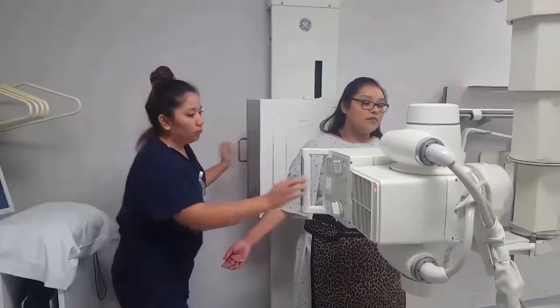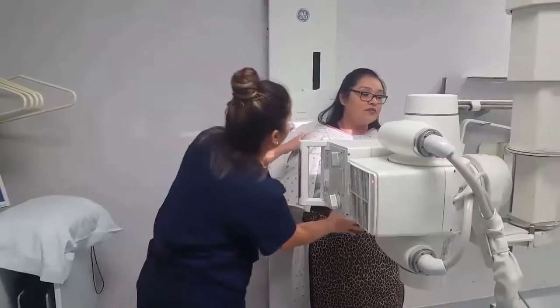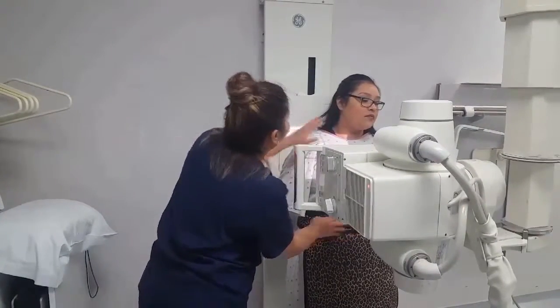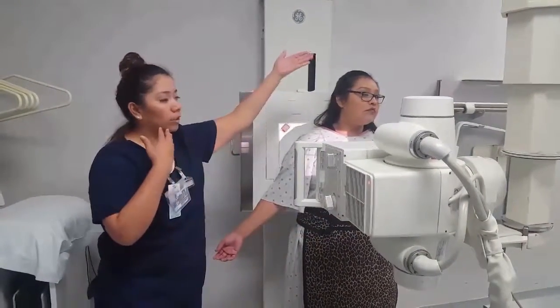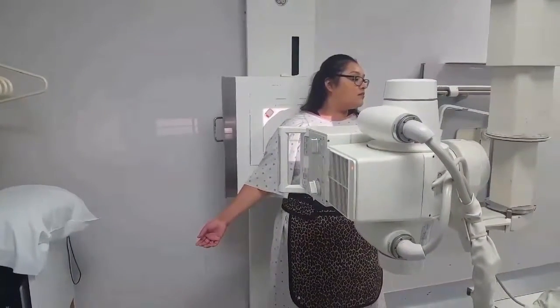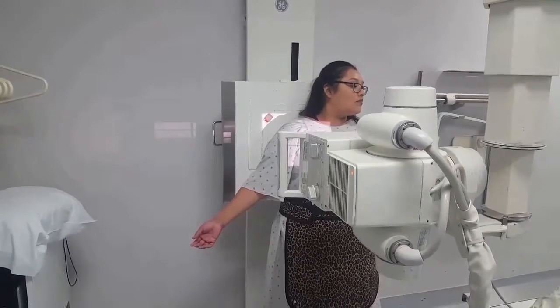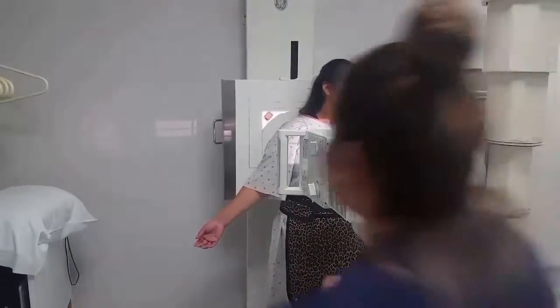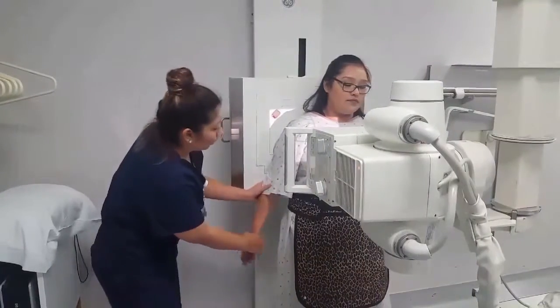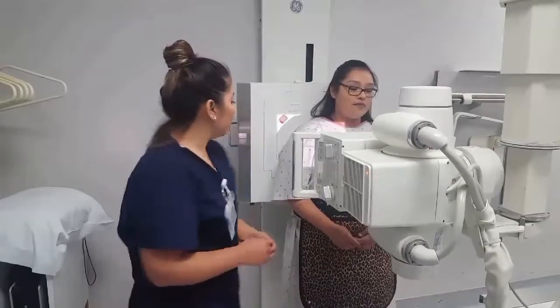Same orientation. So ma'am, if you could stay in that same position you're in, making sure she's there. Her chin is towards the left side. Follow my breathing instructions, please. Take a deep breath in and hold it. Breathe, x-ray. Thank you. You can breathe now. And our technique for this, you can go ahead and put your hand down, was 85 kVp at 10 mAs.